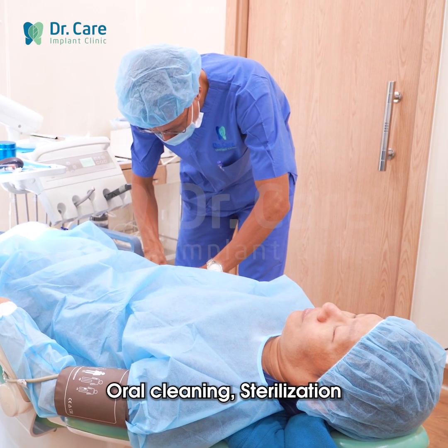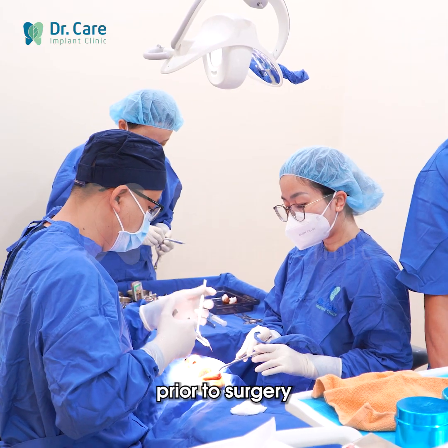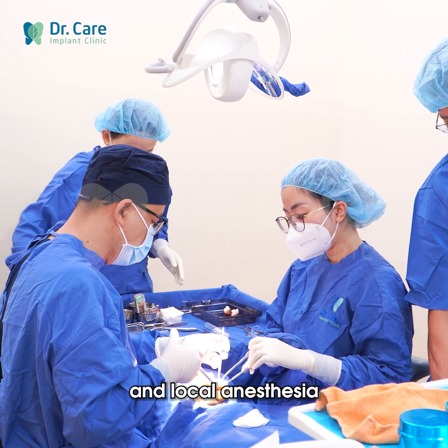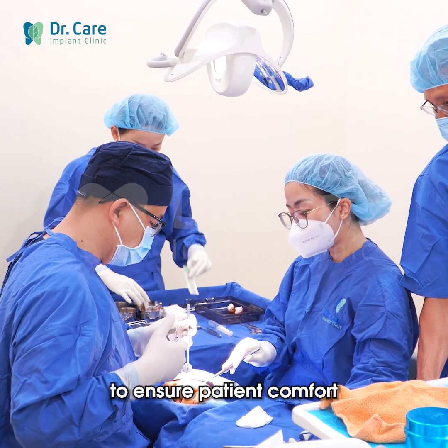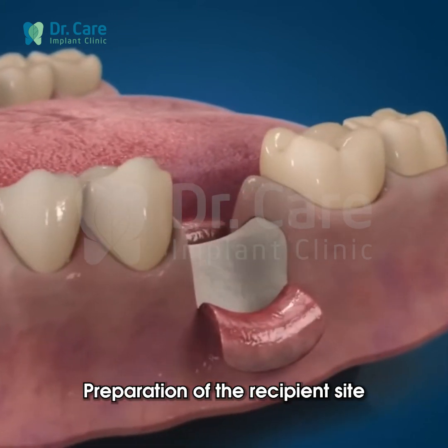Step 2. Oral cleaning, sterilization, and local anesthesia or sedation. Prior to surgery, the surgical site is thoroughly disinfected and local anesthesia or pre-medication is administered to ensure patient comfort. Step 3. Preparation of the recipient site.